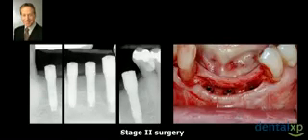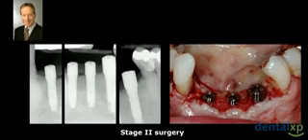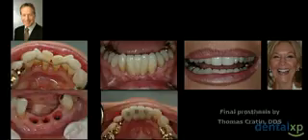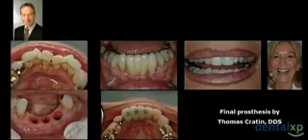Okay, so this is how things looked at the time the implants were placed. We did a delayed approach, as you can tell, because of the bone graft. We're placing our healing abutments on, and this is the environment now that the restorative doctor is working in, knowing full on from the beginning that there were going to be embrasure issues, and this was going to be a screw-retained prosthesis. So this was the outcome for this particular patient.